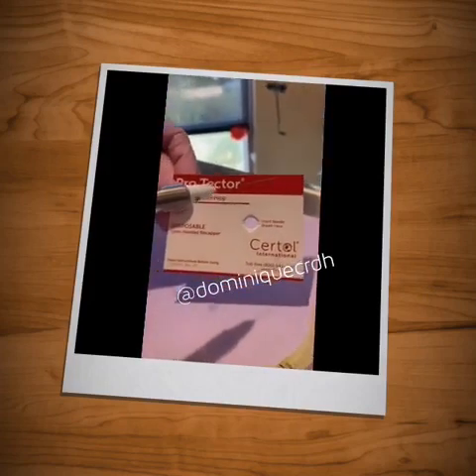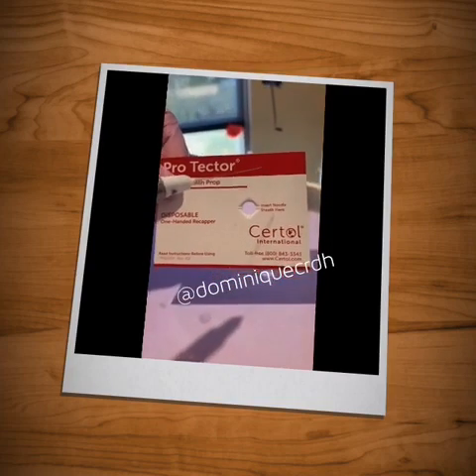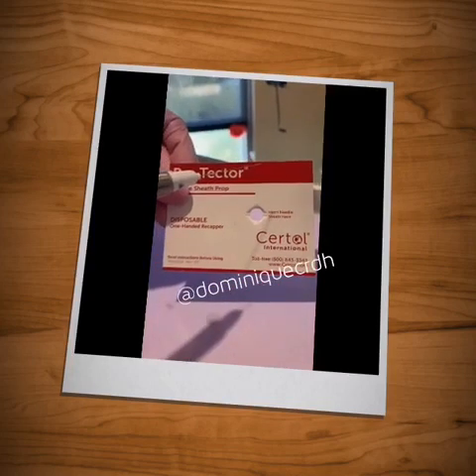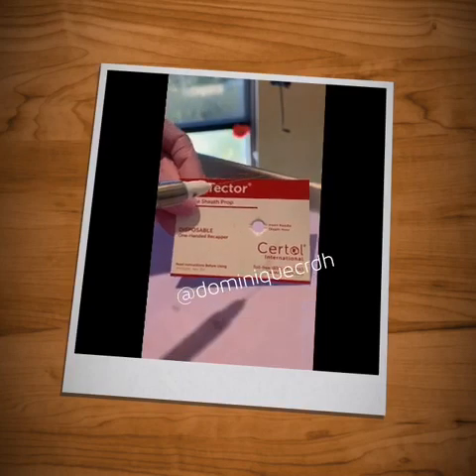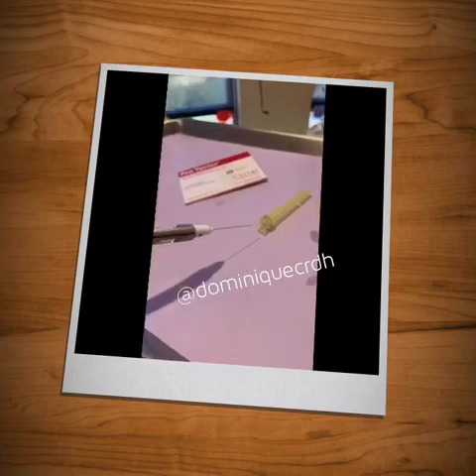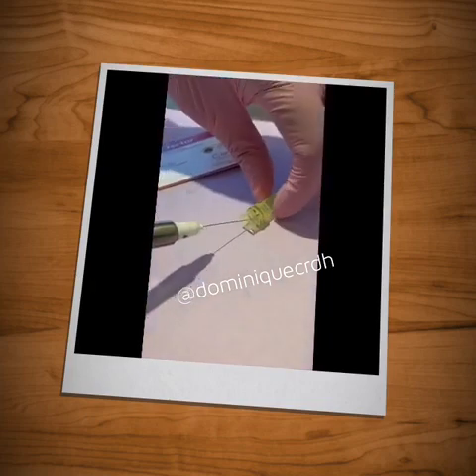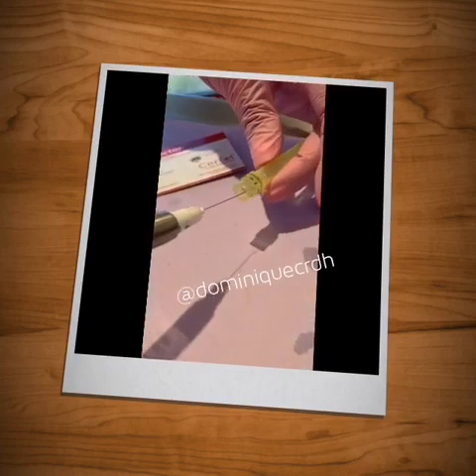After you have done your anesthetic deposit, to recap the needle, you don't want to use your hands to touch the cap at all. You are just going to take the tip of the needle, go to the open portion of the cap, insert, and when you have come in about halfway or a quarter or so, you can pick up the cap of the needle and tighten it.